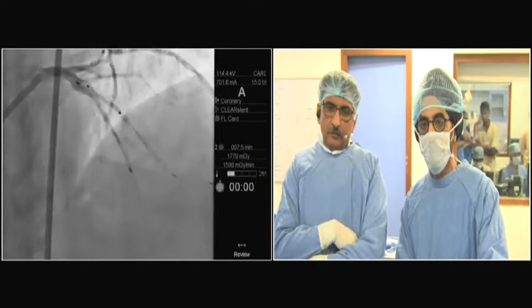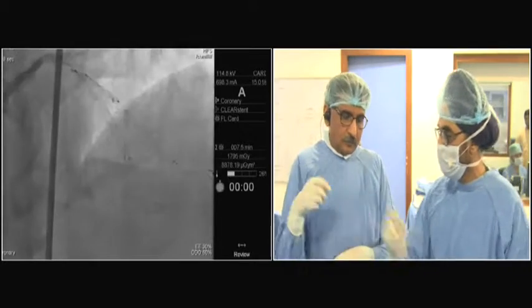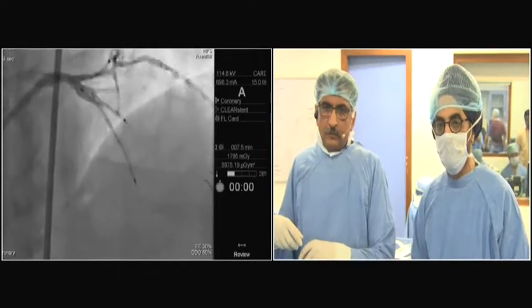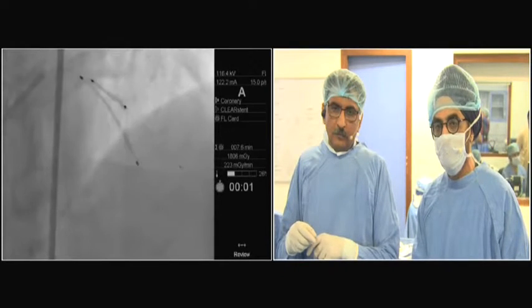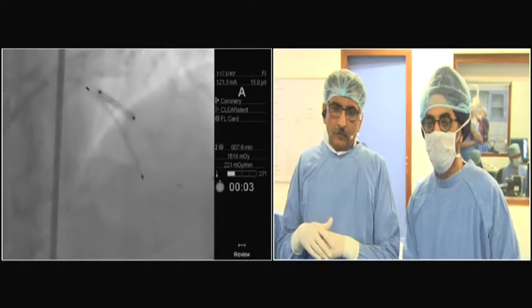I just wonder if any other panelists think the choice of stent may be important, whether using a self-expandable stent in these cases with large discrepancy might take away some of the issues with the conventional stents.